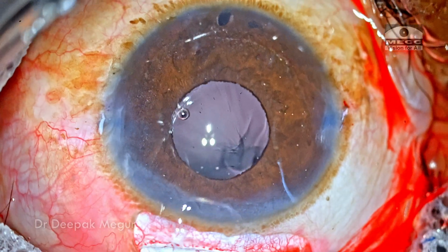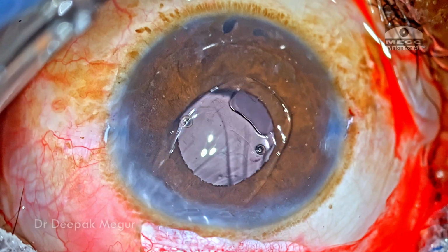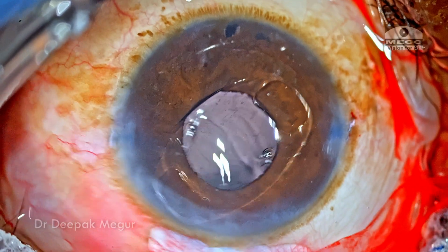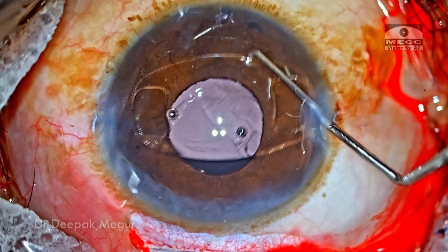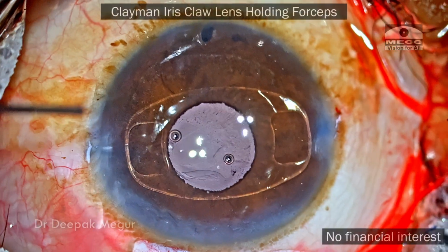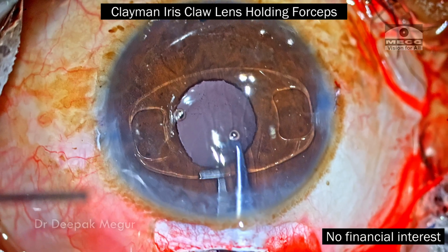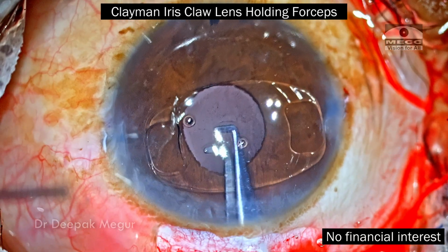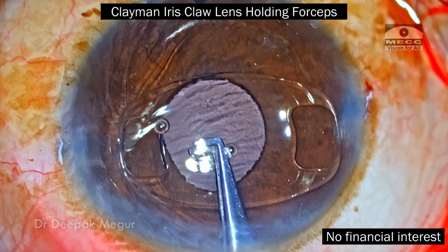The lens is introduced in a longitudinal orientation so that the smallest diameter is used to pass it through the scleral tunnel. Once it's over the surface of the iris, then it is positioned in the horizontal meridian. So I'm going to use the Clayman forceps to stabilize the lens. I prefer to use this forceps because it's not bulky and it's easy to grasp it, and we don't compromise on the chamber stability.